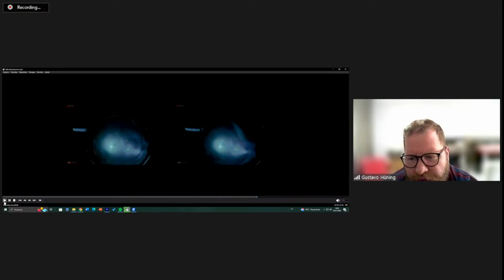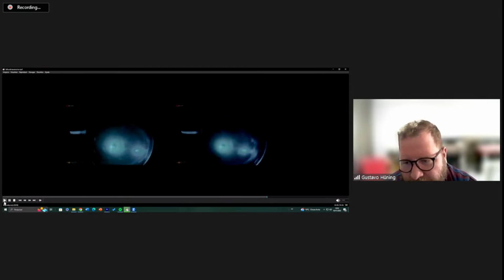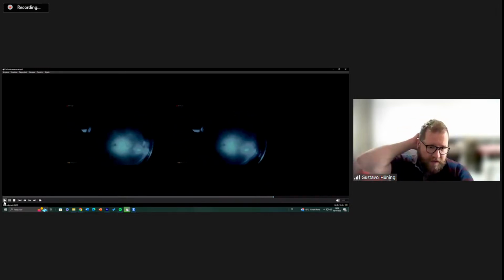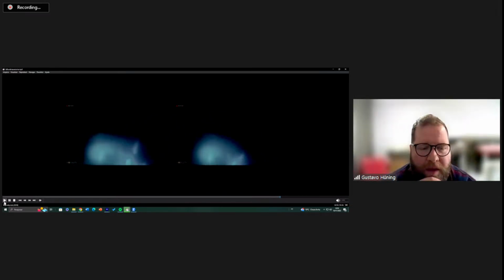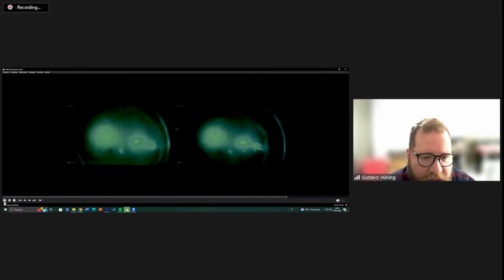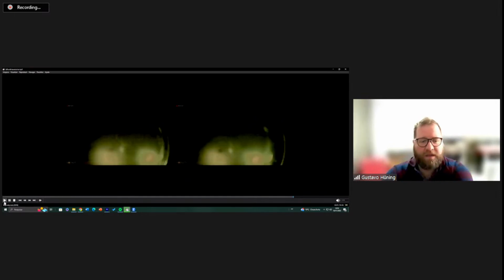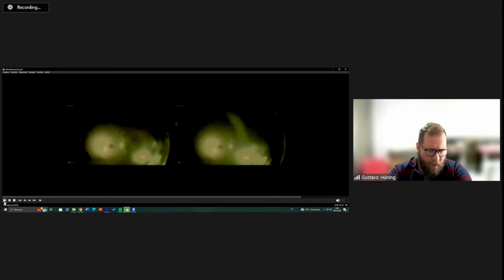In this case, you'll see the macular edema can be better seen with some orange filters, and green gives us a better perspective. This is also something nice about the Ingenuity. We can adapt it to our needs, our microscope, whatever we have. And since each of us sees colors in a different way, it helps us a lot. I don't know if you can see it the same way I see it here, because in Zoom we lose a lot of quality in the transmission.